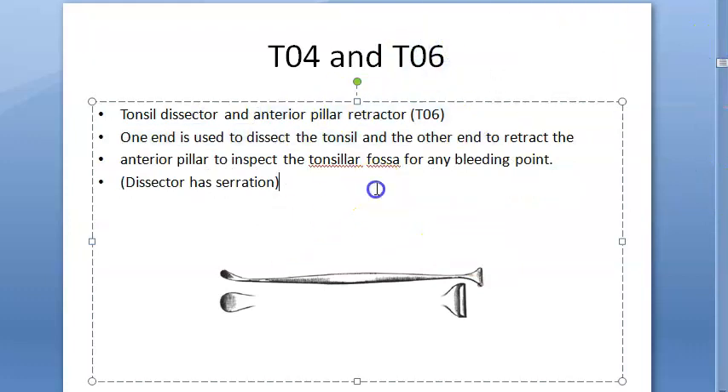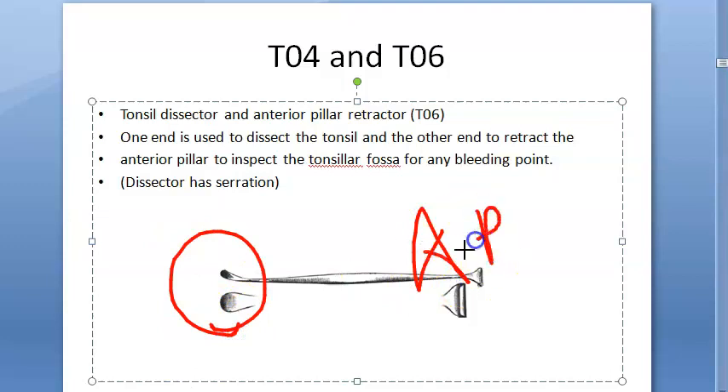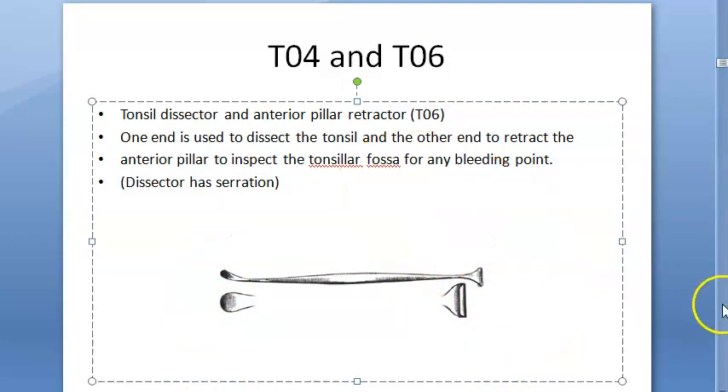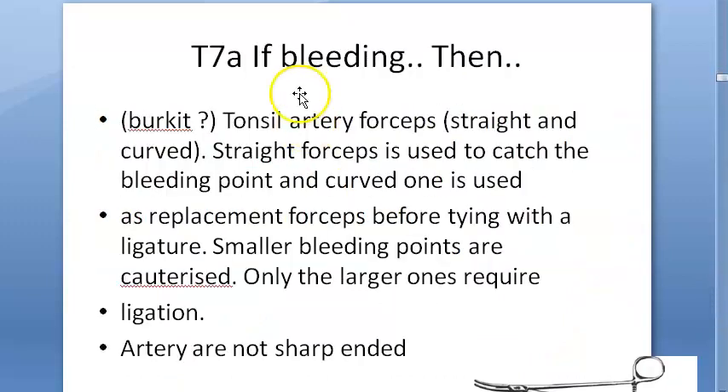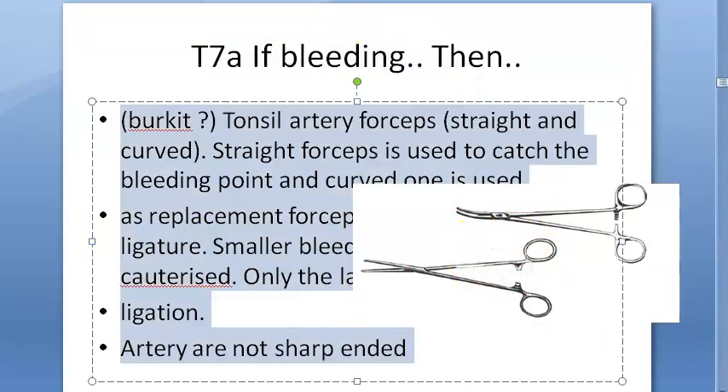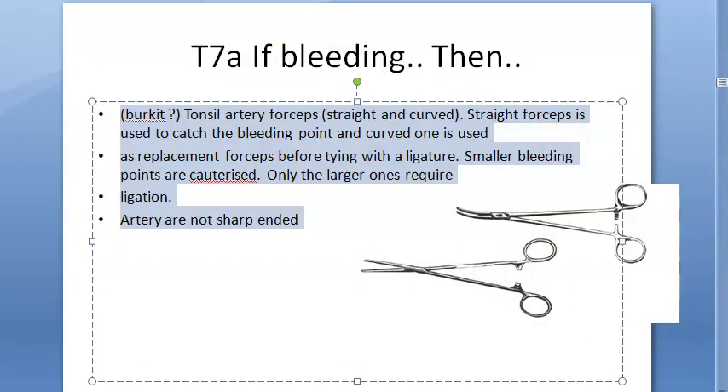This is the anterior pillar retractor. Along with the dissector, you use the anterior pillar retractor — you can see it's like a retractor. You will use this to check if there's any bleeding, and then if there is bleeding you will use the artery forceps. These are the Birkett tonsil artery forceps.